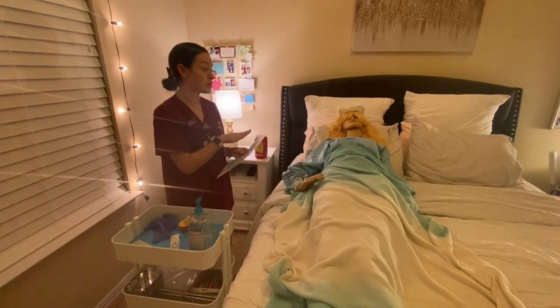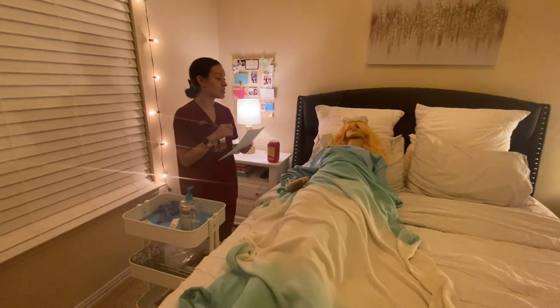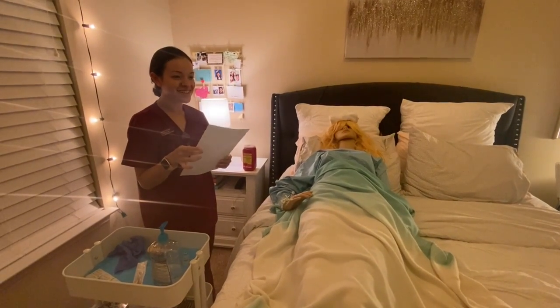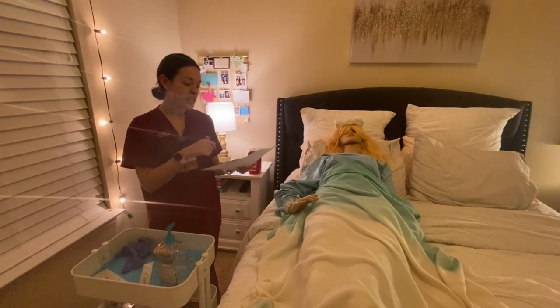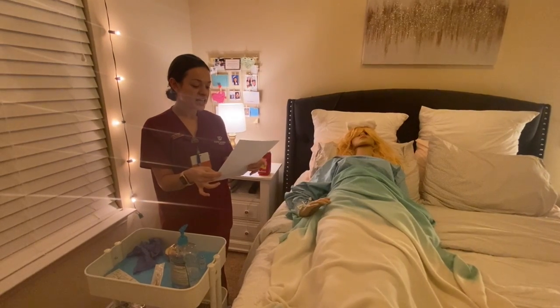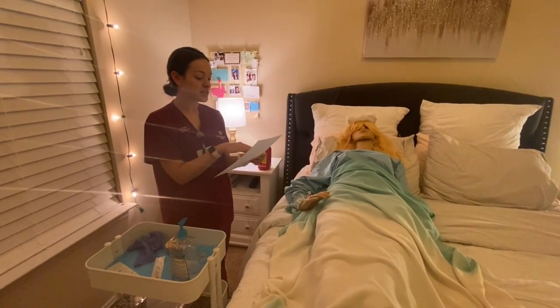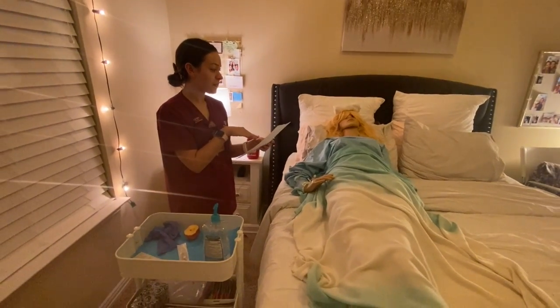Oh, before I do so, let me provide privacy, okay? I also need to confirm with the faculty your morning glucose levels, okay? And what was that? 155. Okay, thank you. So your morning glucose level was 155. So I'm going to use the sliding scale insulin. And because it's 155, I'm going to do 4 units of regular insulin plus the MD's order of 30 units of insulin, okay? Okay, great.